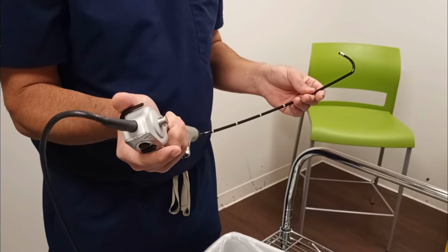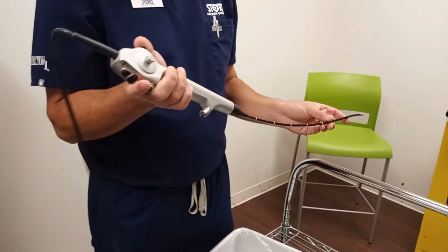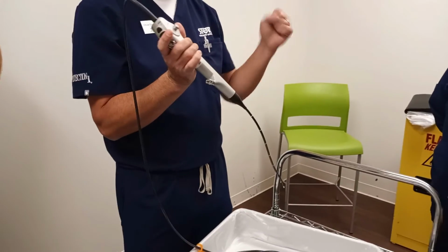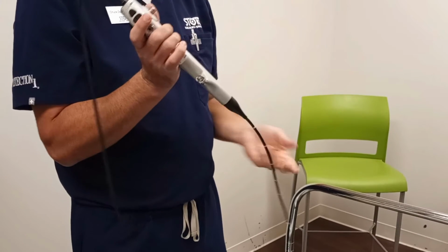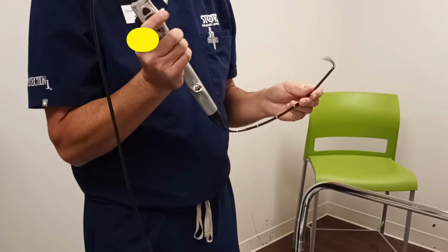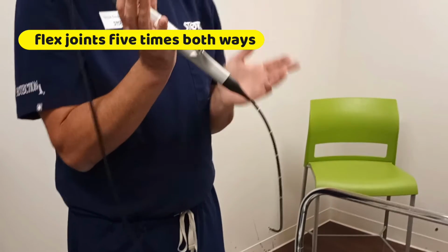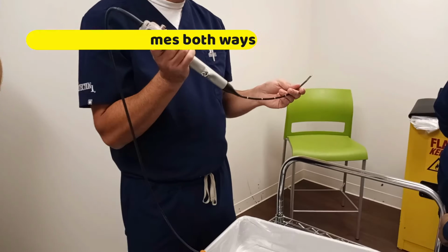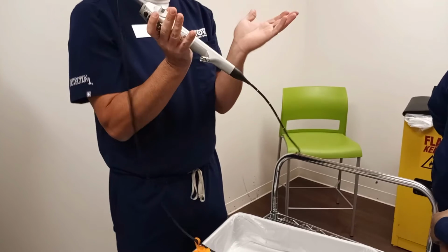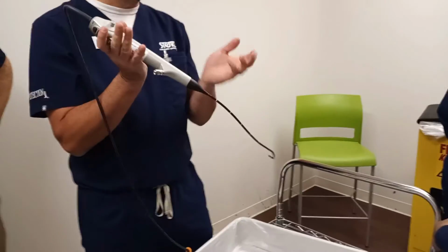While you have the leak tester attached, what this does is, if you have it in a straight formation, just think of it like a scab, right? It's closed. So you're going to deflect it 5 times in each direction. The purpose of deflecting it is to open up any potential holes that might be sealed while in the straight formation. Hopefully it will open up what might be an exterior cut on the shaft of the scope, and it's going to release that air.